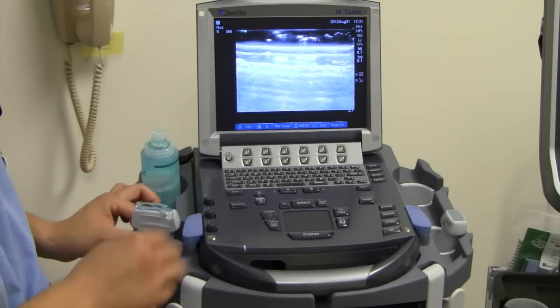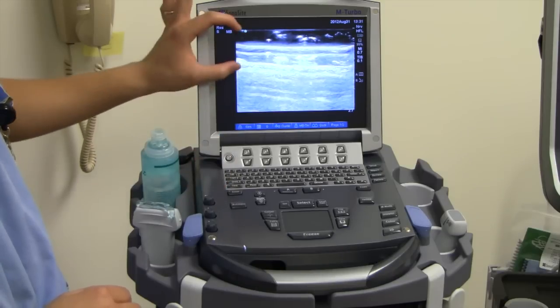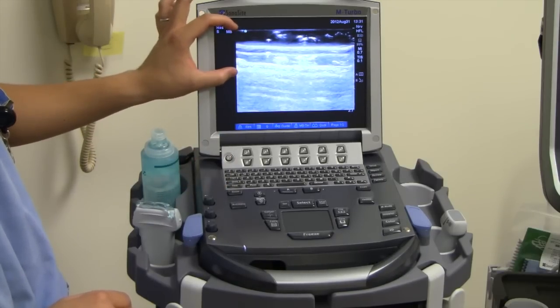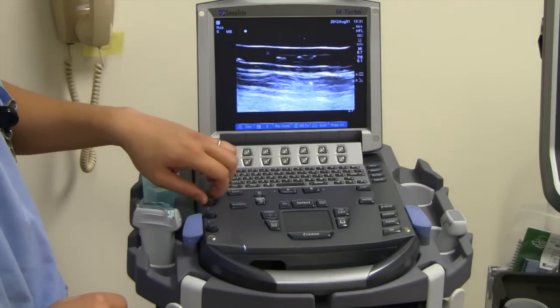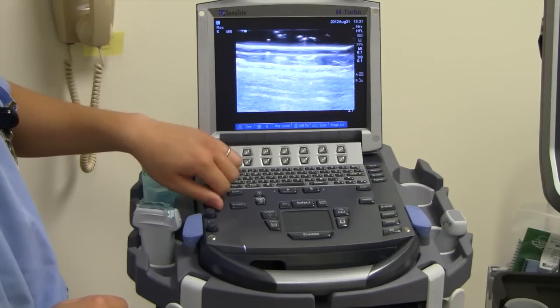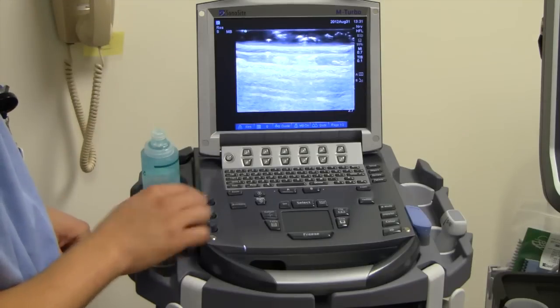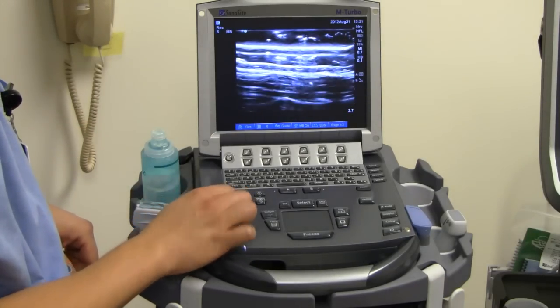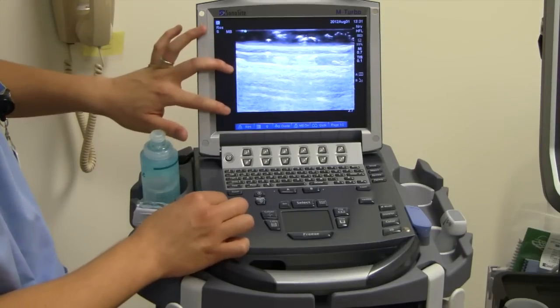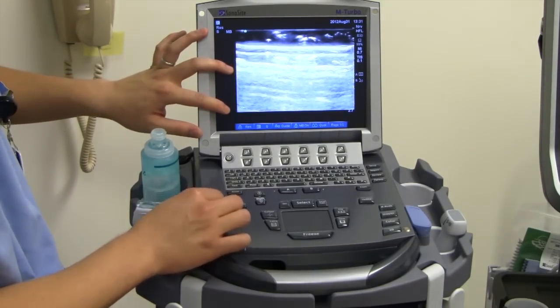The top-most knob right here is going to be for what we call the near-field gain. So for the top part of the screen, it's going to turn dark and bright based off of this knob right here. This button right here is called the far-field gain, and by turning this, you're going to get increase or decrease in gain for the far part of the screen. That's how you use gain.